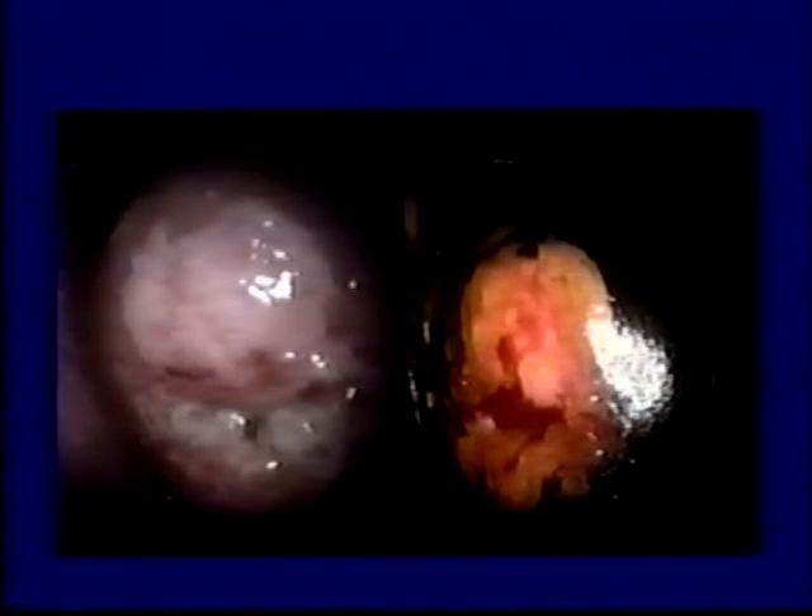After sampling is completed, no bleeding is noted. After the pap smear, 5% acetic acid is applied to the cervix followed by a Lugol solution. The staining demonstrates the extent of the lesion which was covered in entirety by CellSweep during sampling.